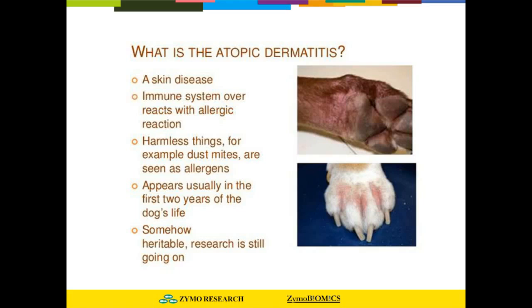And Boo Boo was given anti-inflammation drugs for the treatment. My colleague Mark was suspicious about the diagnosis and decided to conduct a simple microbiomic study. So he collects samples using a swab from the disease spot and saves the samples in DNA/RNA Shield. Boo Boo recovers slowly over about 1 month, and after recovery, Mark collects a sample from the same area and then sends those samples to us for microbiomic sequencing.